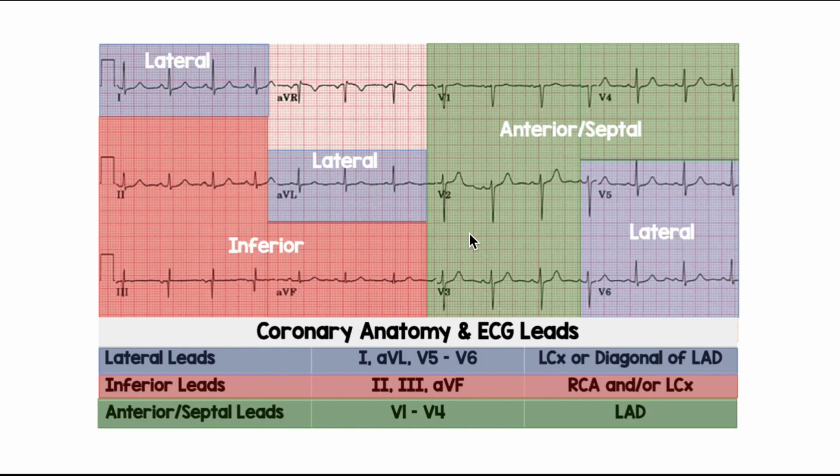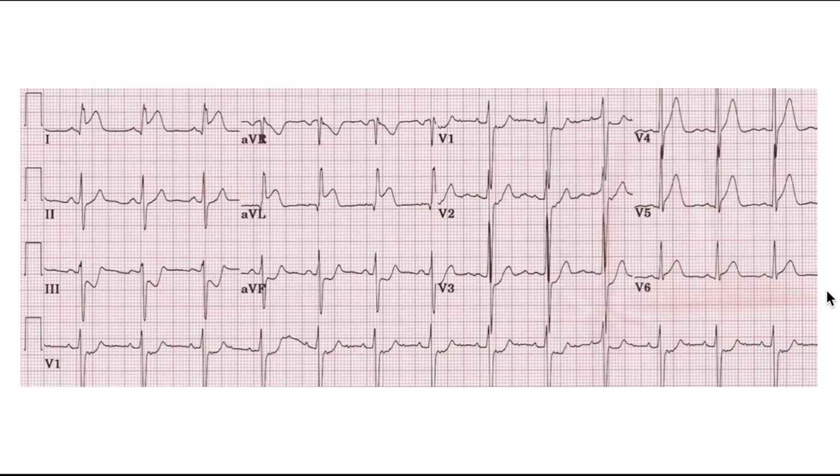Here's my favorite picture ever to help me determine where infarcts are. It tells you which leads are which type of infarct, and additionally what vessel is occluded. So memorize this, print it off, take it with you. It will save your life and other people's lives.